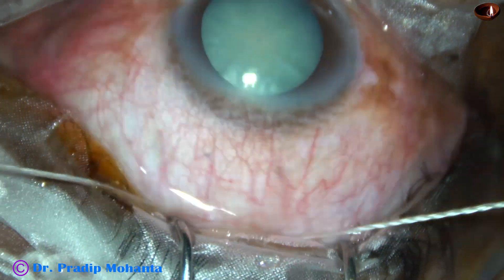The assistant keeps on putting BSS drop by drop, and bipolar wet field cautery is carried out. After this, we are going to place the main incision.